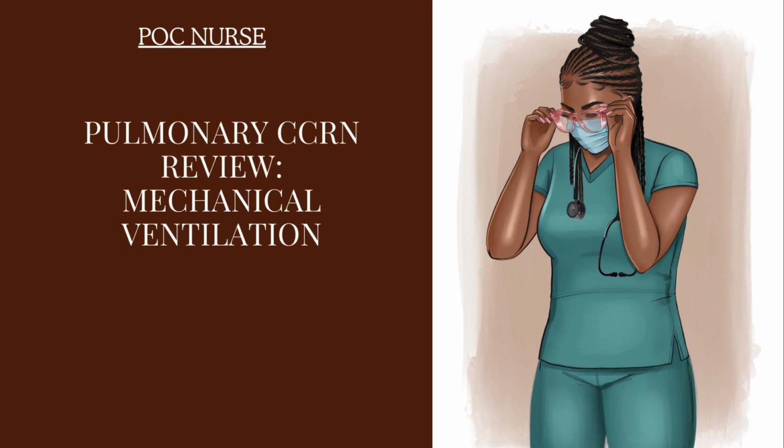The respiratory rate or breath rate is how many breaths per minute the ventilator is going to give the patient. The PEEP is the amount of pressure that's going to keep the alveoli open, and the FiO2 is the amount of oxygen that the patient is going to be getting.